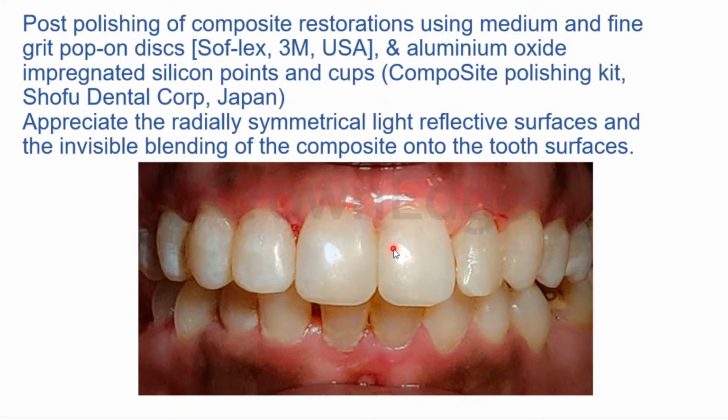So a trauma case where a guy just fell down, broke his tooth into half, near the cervical third. It was a crown root kind of a fracture, or probably just a crown fracture. It was extending slightly towards the root, which we could reattach using the e-glass fiber post, anatomic post. We used Everstick in order to bond that fragment back to the tooth.